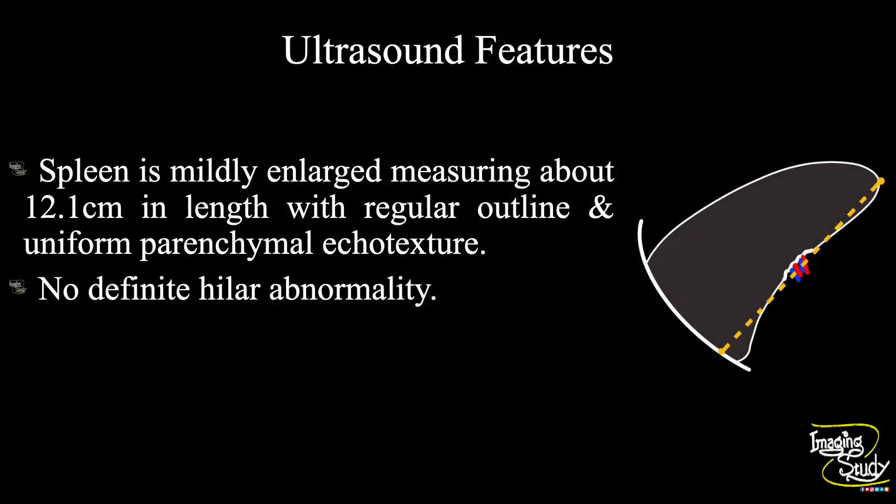So in summary, the spleen is mildly enlarged measuring about 12.1 centimeters in length, with a regular outline and uniform parenchymal echotexture. No definite hilar abnormality is noted. So the diagnosis is mild splenomegaly.